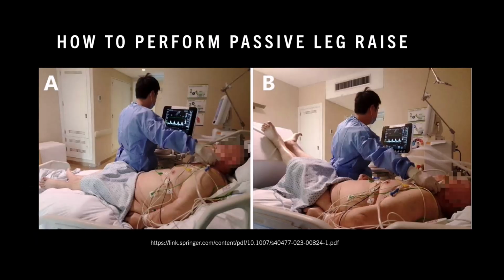So if you're wondering, how do I perform this passive leg raise while also obtaining cardiac or carotid artery measurements with the ultrasound, I added this nice little picture to show you how that is done. It's pretty feasible to be done all at the same time. Sometimes it requires help from a friend with the passive leg raise component.